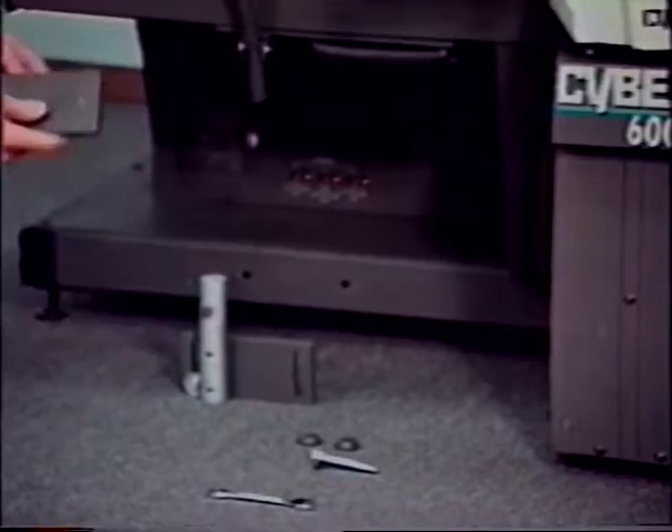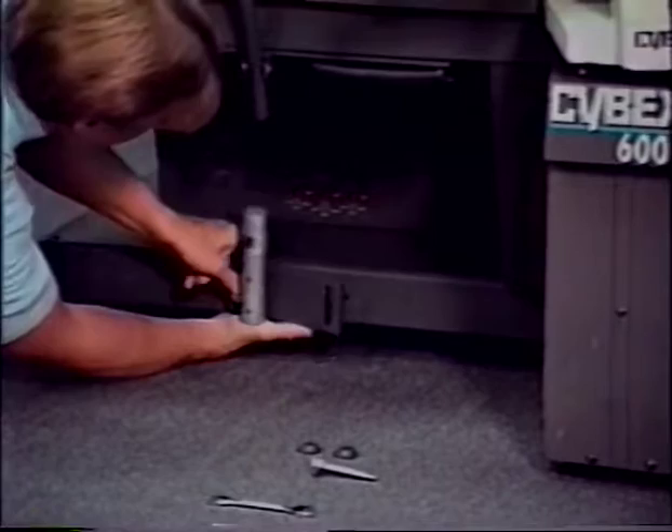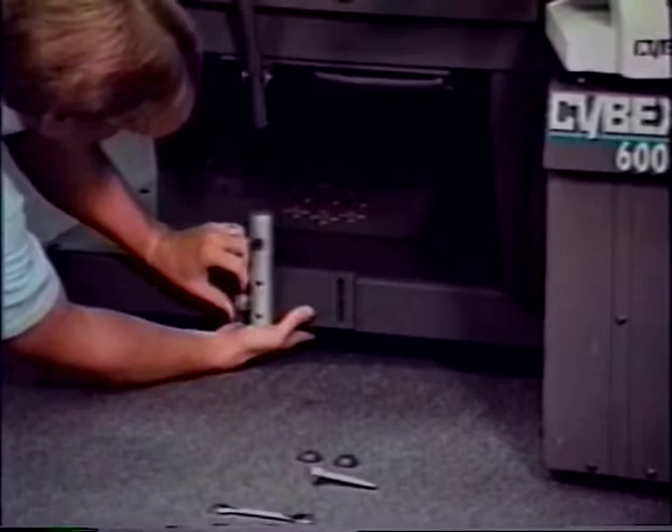Hold the backing plate against the rear of the front base frame rail in line with the existing holes. Position the docking post against the front base frame rail. Slide the screw through the base frame rail and thread it into the backing plate. The screw should be installed finger tight only.